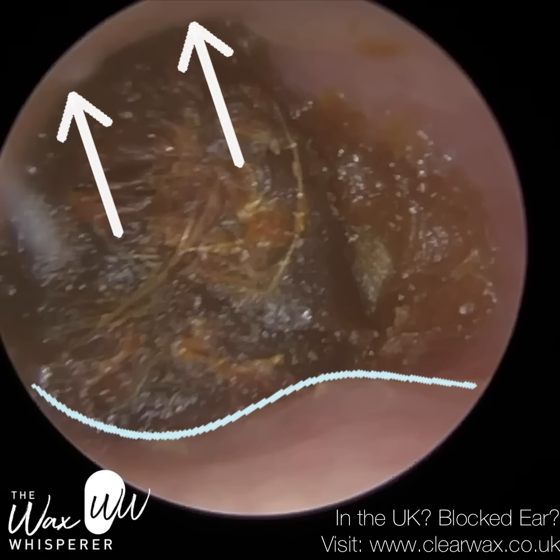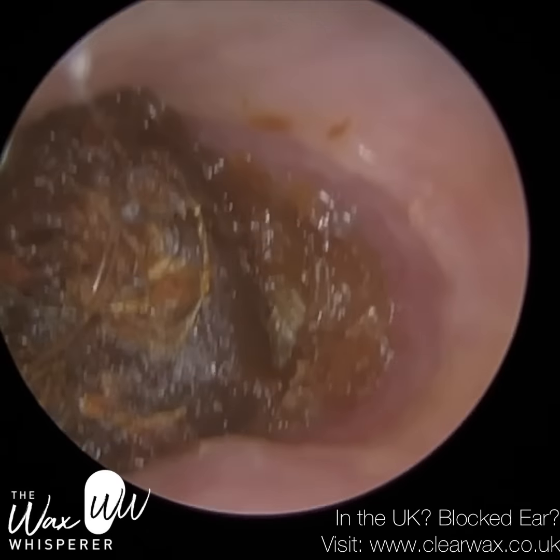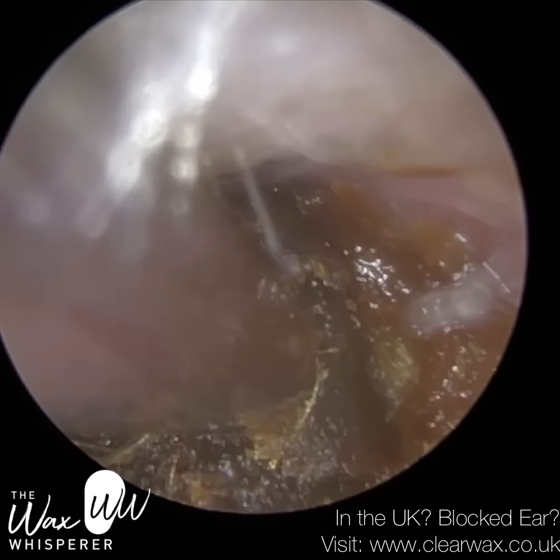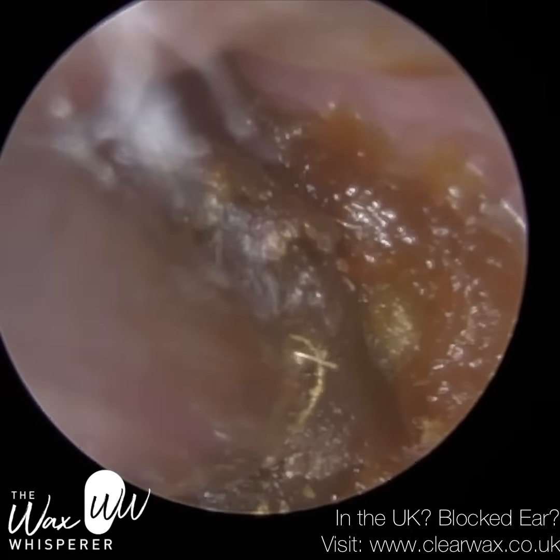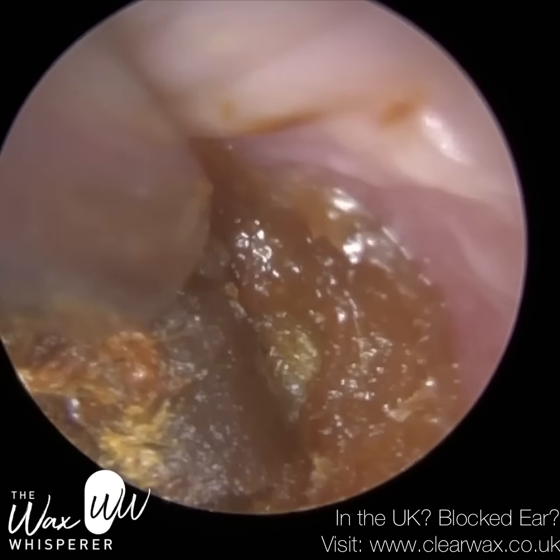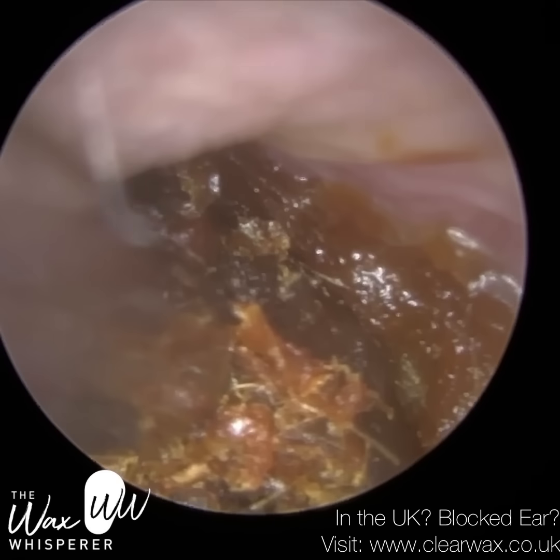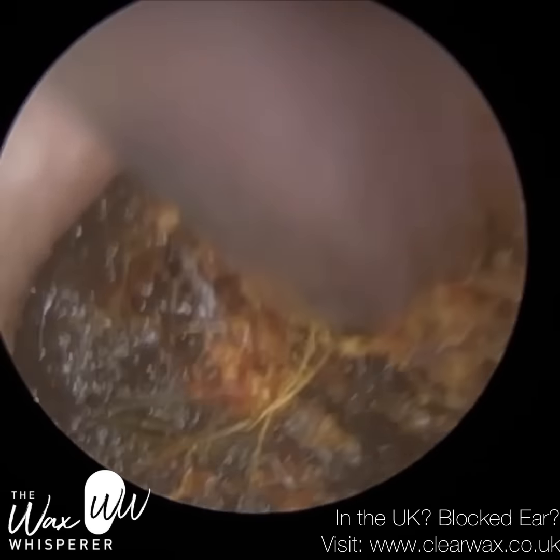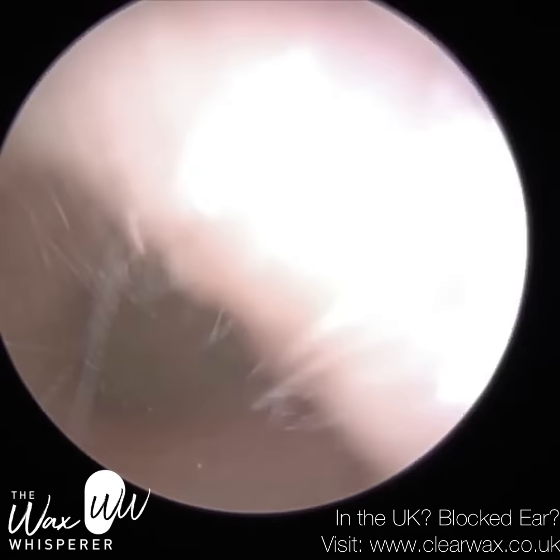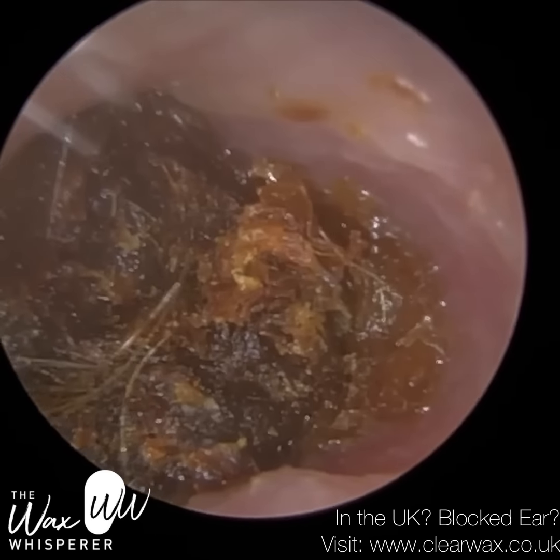Not only is it compressing against the eardrum, and I'll come back to that, but where I've got the 2 arrows, that's where the ear canal is widened, and you can see at the bottom that arc. The patient has got a natural protrusion of the anterior ear canal wall, and both of these things are making this really difficult to remove. So this rubber ball is expanding and it's compressing against the ear canal, and the bone that surrounds the ear canal, the temporal bone, is the second strongest bone in the body behind, I think it's the fibula, if memory serves me correct. And no, sorry, the femur. Sorry, I do apologise. It's the femur.